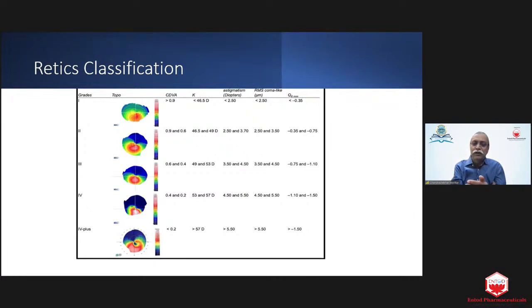But at the same time, we have to understand that we do not know how accurate it is. So in a nutshell, this is how I will go. First is classify the type of keratoconus according to newer classification. Do some smoothing procedure or get the cone central, and then first talk about astigmatism and then approach. Now, I always calculate by both the methods, whatever number of methods are available, and try to put a mean IOL power. Of course, I have not done too many cases, just theoretical discussion.